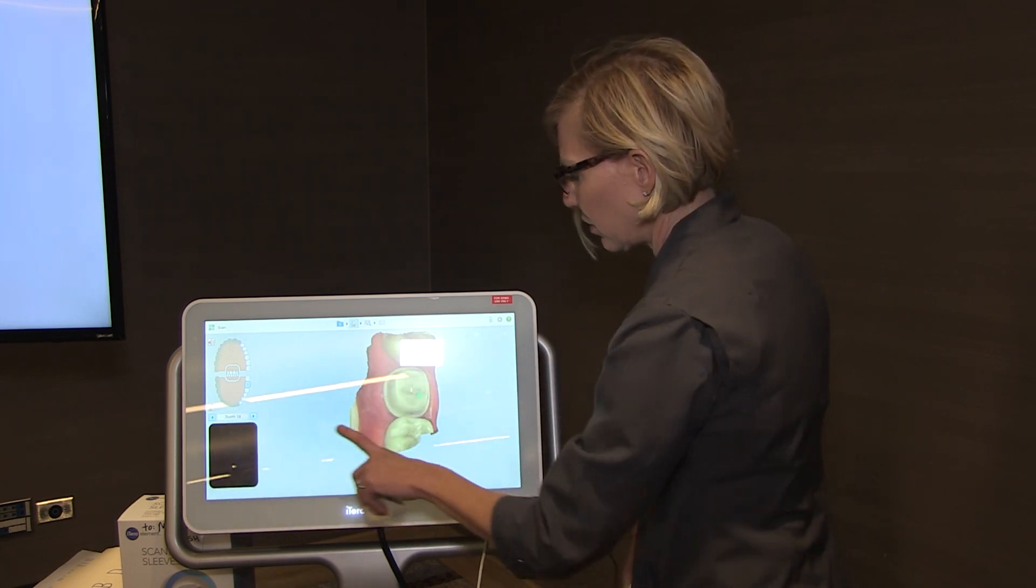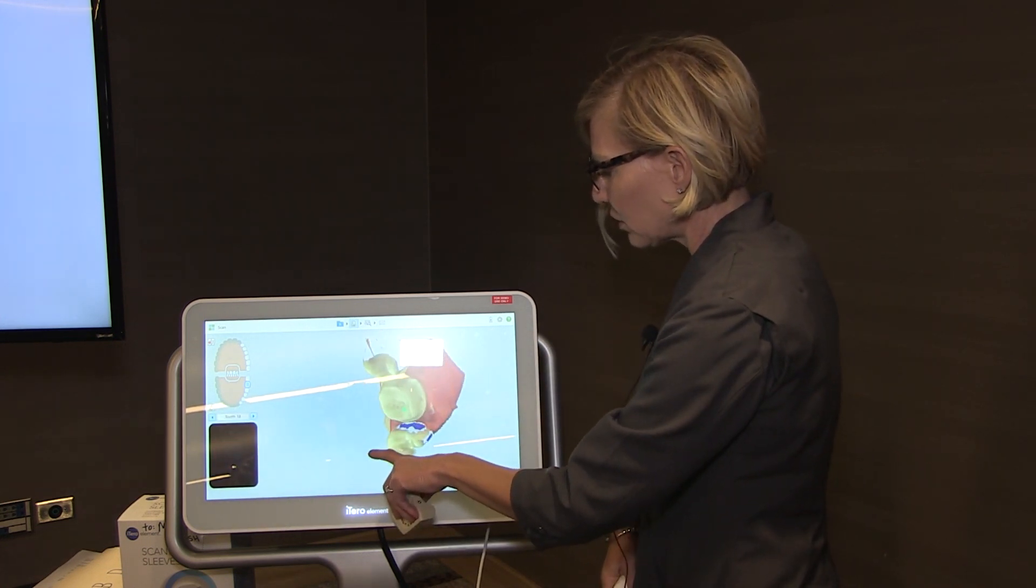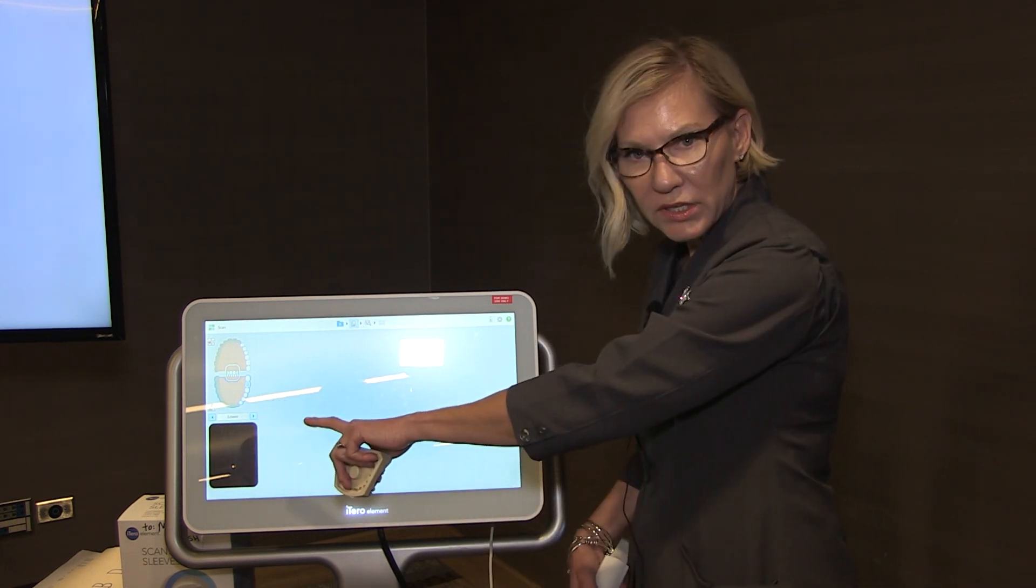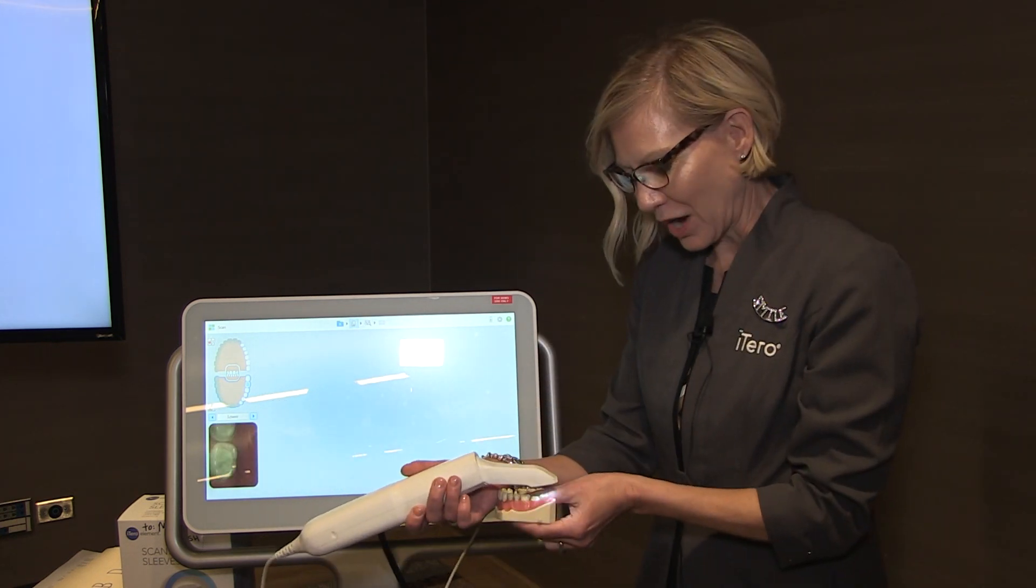Change your scan to color often helps you to be able to clearly see that margin line. Now I'm going to do a quadrant scan because this is a single unit crown.